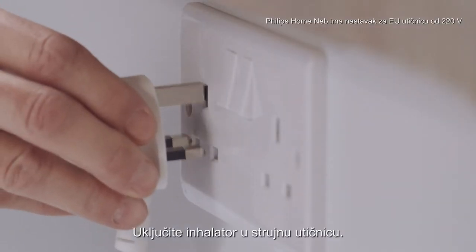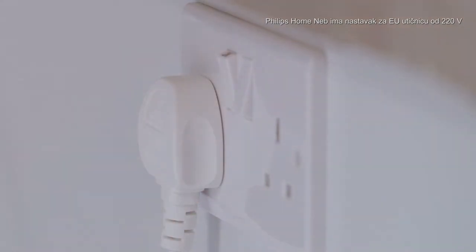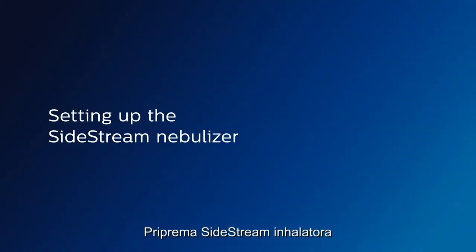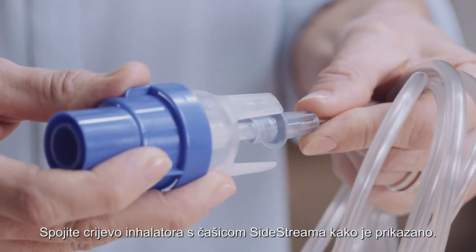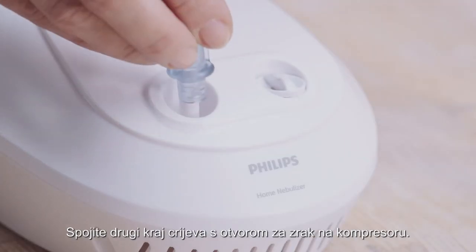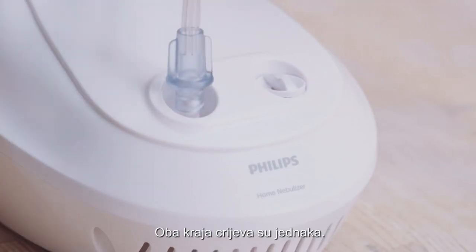Plug the power cord into the electrical outlet. Assemble the Sidestream Nebuliser cup and air tubing together as shown. Attach the other end of the tubing to the air outlet on the compressor. Both ends of the tubing are the same.